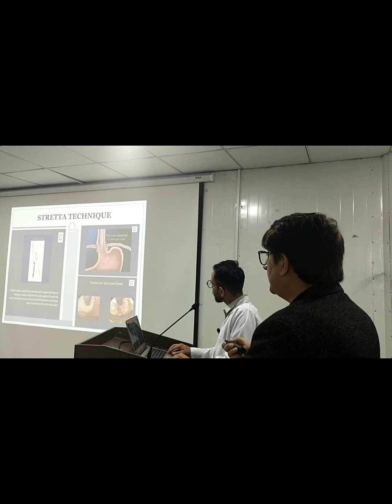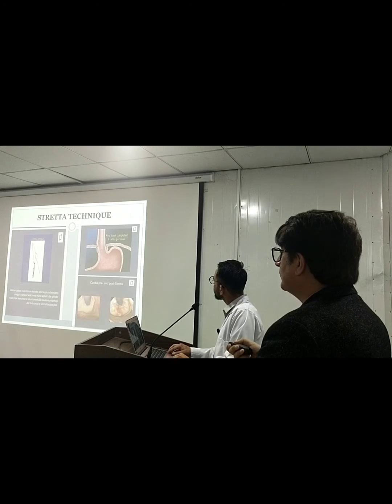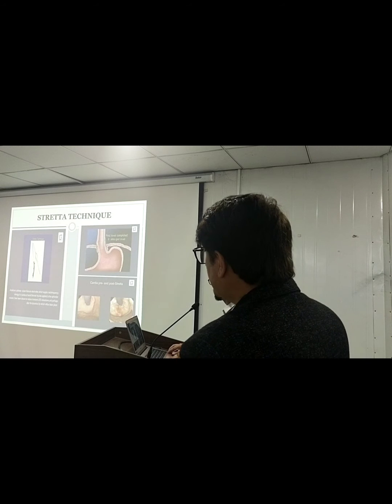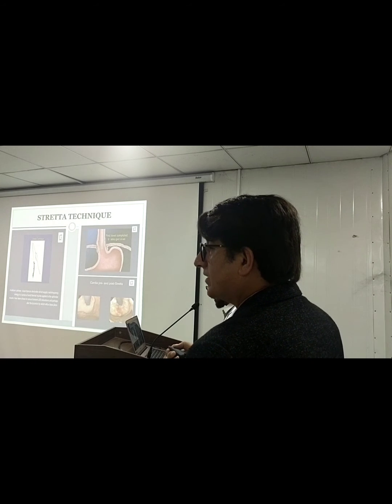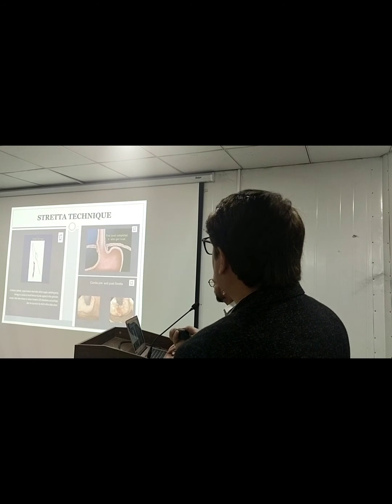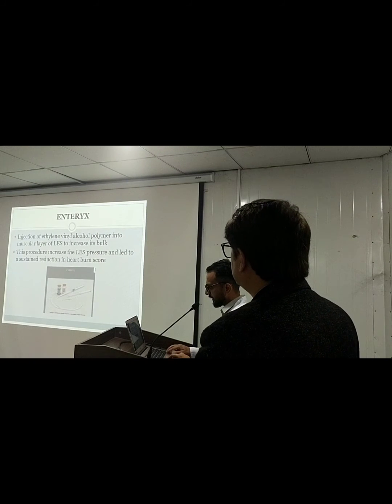With the application of this technique, the use of PPIs has reduced from 80% to almost 23%, and the GERD and heartburn score has decreased by almost 35% in 1 year. So these are the pictures pre and post Stretta technique.